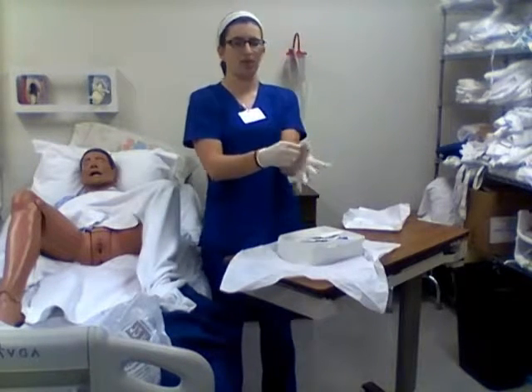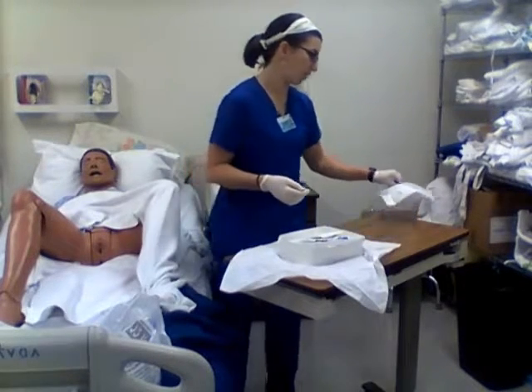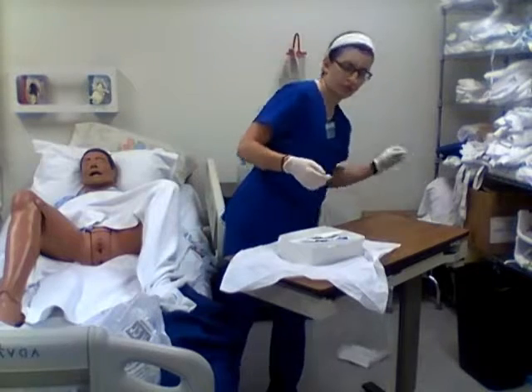All right, when we're done with that, we can go ahead and dispose of our wrapper by touching the inside. We're not going to contaminate our sterile field. You can throw that away.